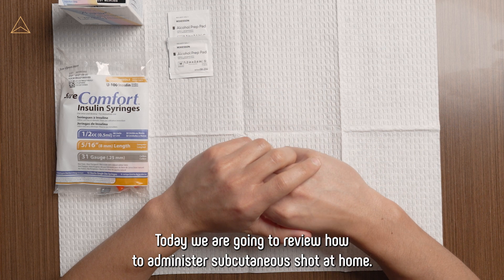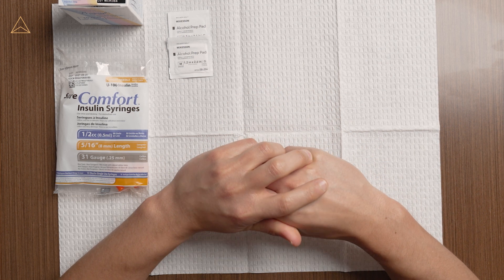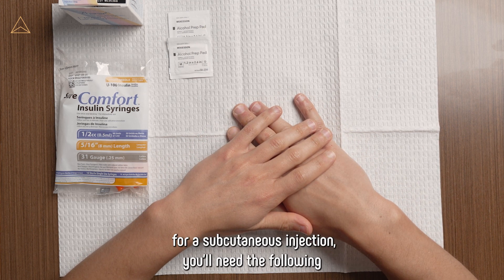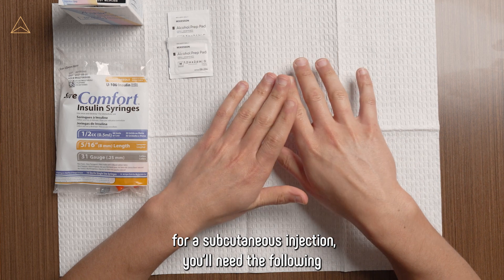Today we are going to review how to administer a subcutaneous shot at home. To get started, arrange all of the necessary supplies on a flat surface. For a subcutaneous injection, you'll need the following.